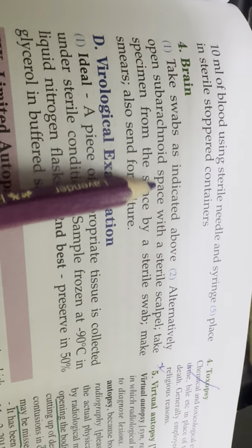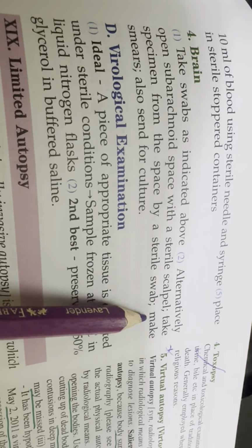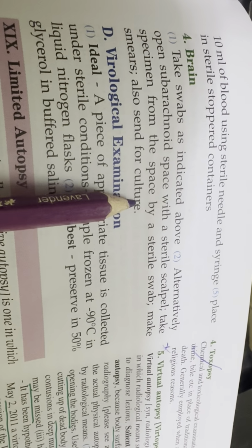Alternatively, open the subarachnoid space with a sterile scalpel. Take samples from the space with a sterile swab. Make smears. Also send for culture.